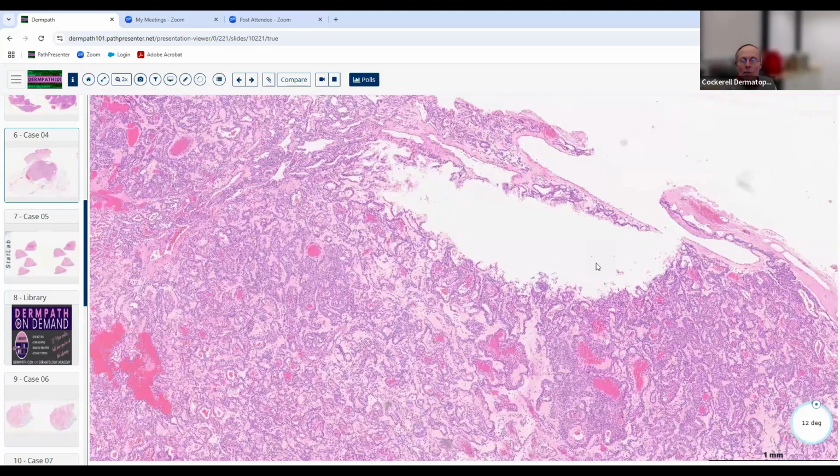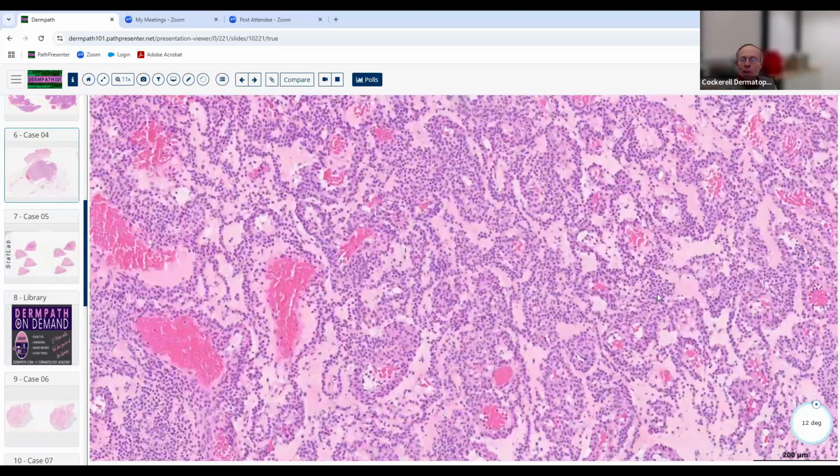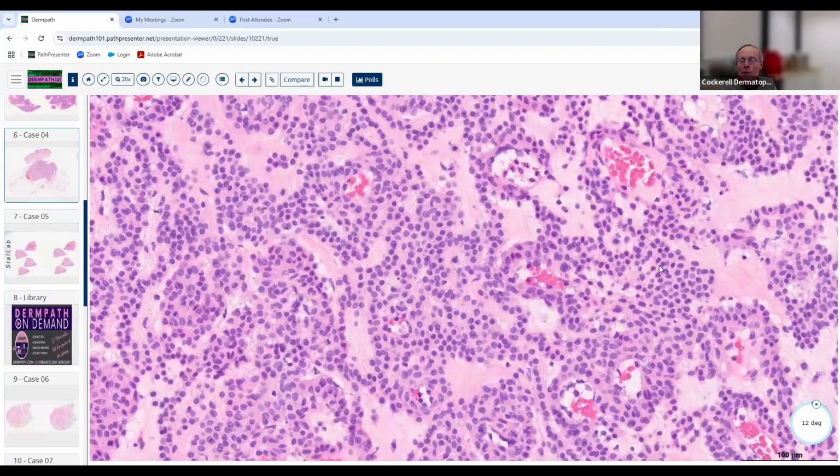So what's the differential diagnosis of lots of these little clonal-like cells that you see here, when cells look very much like one another? So this is one thing that you should think about. Some of the adnexal tumors, and some of the hidradenomas, for example, those cells can be very small and blue and cuboidal and can look very, very similar to one another that are not atypical. And again, there's really no atypia here. And mast cell lesions, those cells also can look very, very monotonous, if you will. Probably monomorphous is a better term, but the individual cells look very much like one another.